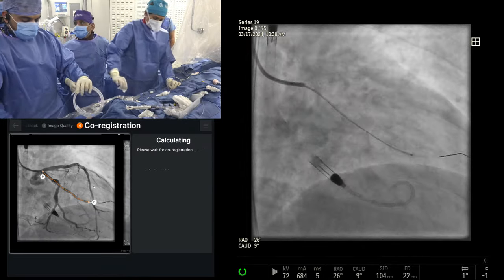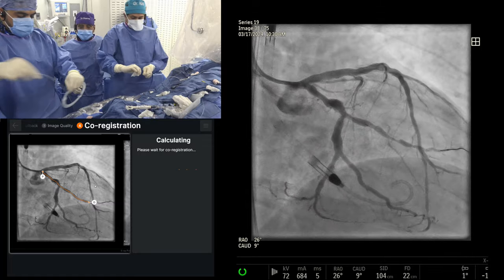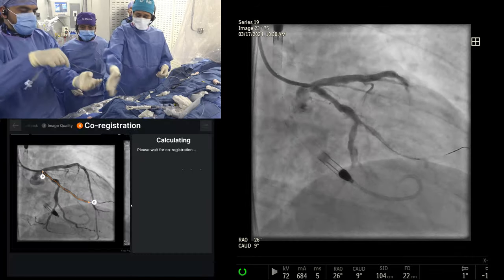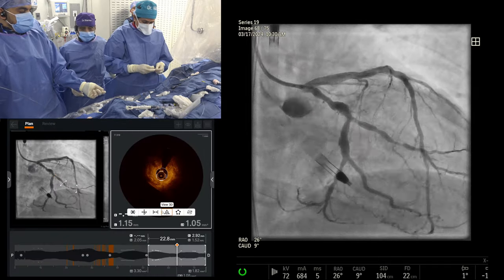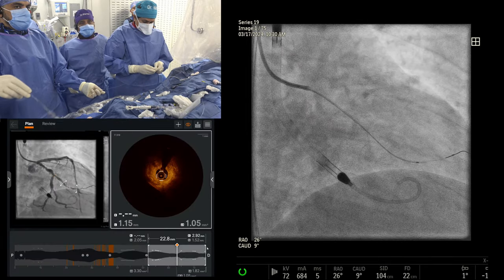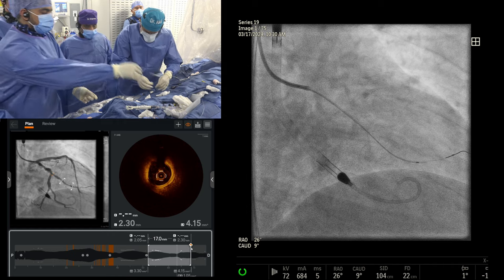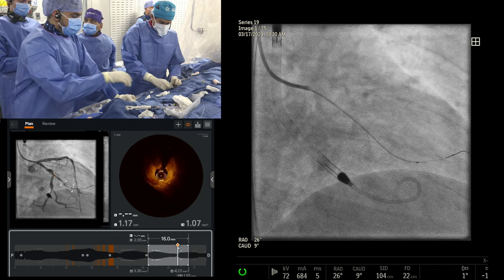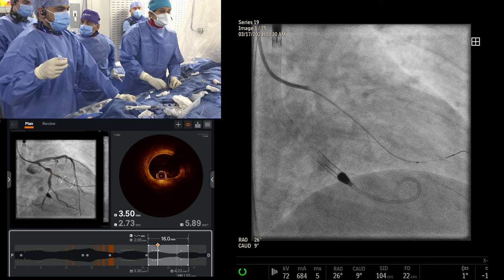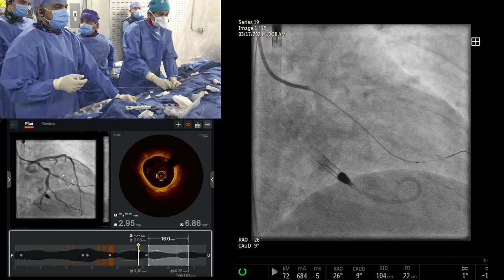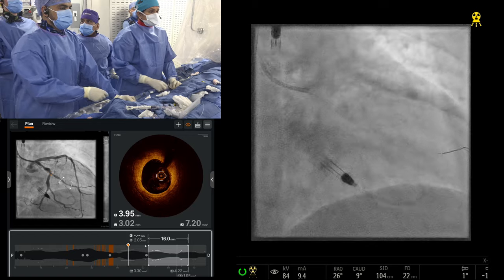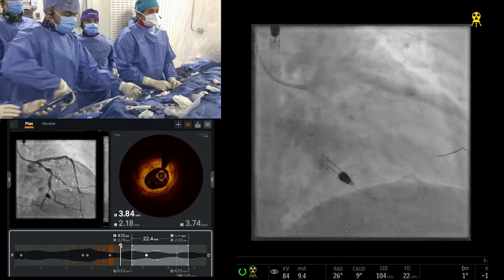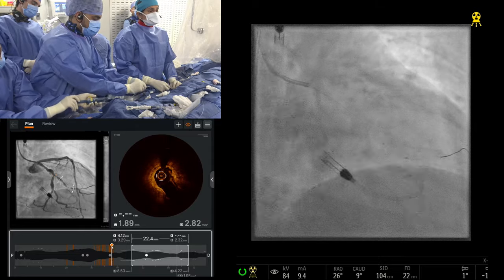If your EDP is 14, why are you putting in an Impella? Every live case this is asked. But your EDP of 14 will become 28 within 30 seconds when you start intervening these cases — that was never the exclusion criteria. Yet the question is always asked: if EDP is good, do you really need Impella? Maybe Greg can answer that. Now, tell us — we dilated the tightest area. What about the proximal OM?